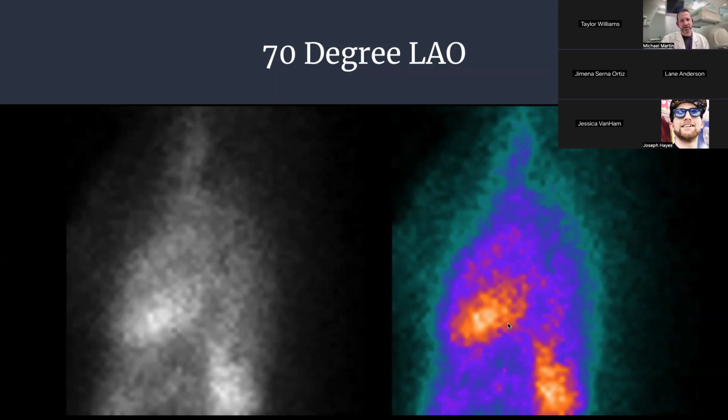What you'll notice with this picture, and I talked about it a little last time, and I'll probably reference it in every lecture, but remember how your heart sits in your chest, okay? The heart as a cup is going to sit so that the anterior part of your heart is actually slightly to the left. Your apex is towards the front of your body, and the base, in other words the opening of the cup end, is towards posterior, right? So your heart sits a little different in your body. It's not perfectly anatomical with the rest of your body, and you can see that right here. But it gives a really good view for either the cardiologist or radiologist to look at this and say, okay, if I can't tell where I'm looking on here, then I can compare this image and get a really good idea of where we're at. And for you as a tech, as you're drawing an ROI, which we'll talk about next.